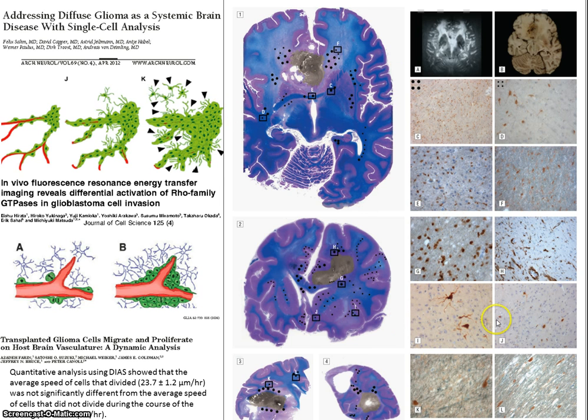This entire panel on the right hand side is from this study in the Archives of Neurology, volume 69, number 4, April 2012. And they used an antibody staining the mutated IDH1 enzyme, the H09 antibody, I guess. It's not perfect, but it's very interesting. First off, they had whole brain paraffin sections to be able to stain on this. But anyway, here's some of the staining. It just reminds us of what we're dealing with and what we're focusing on.